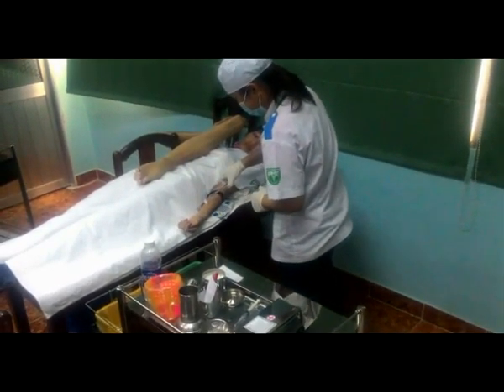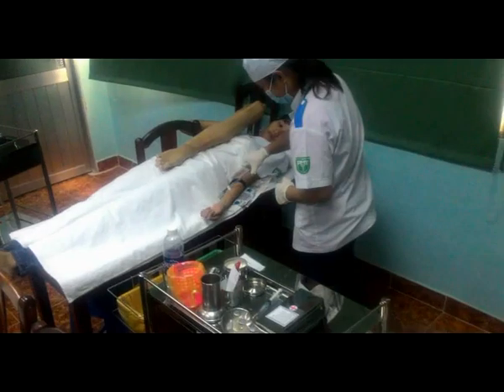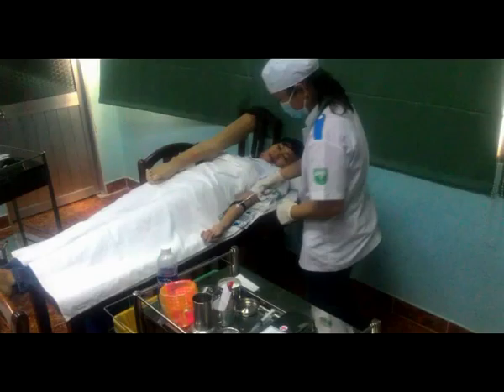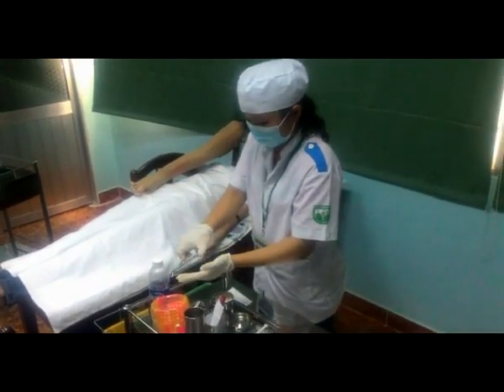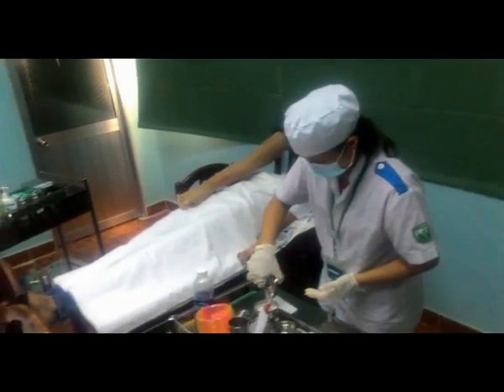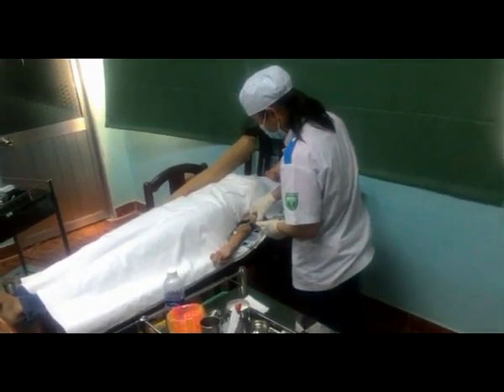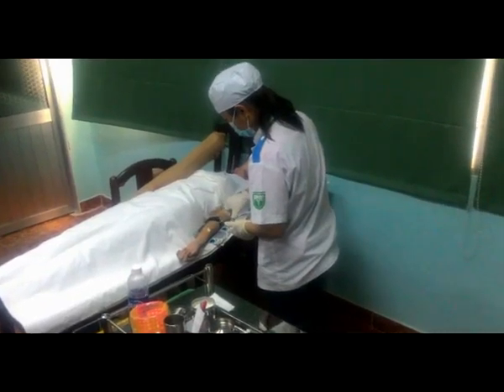Sát khuẩn da bằng gòn cồn iốt 1 phần ngàn. Sát khuẩn theo hình xoắn ốc, rộng ra xung quanh 5cm, sát khuẩn cho đến khi sạch.